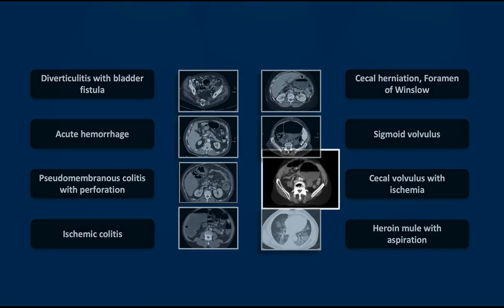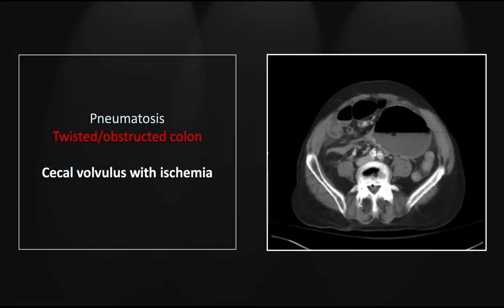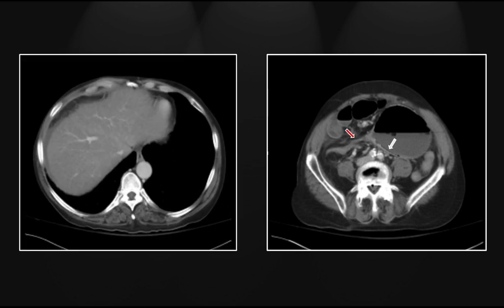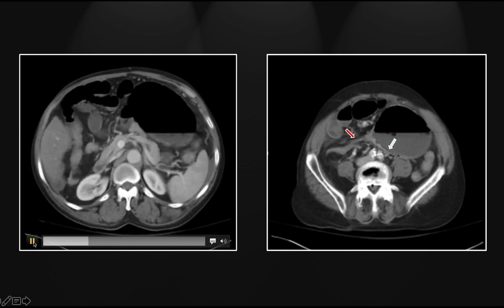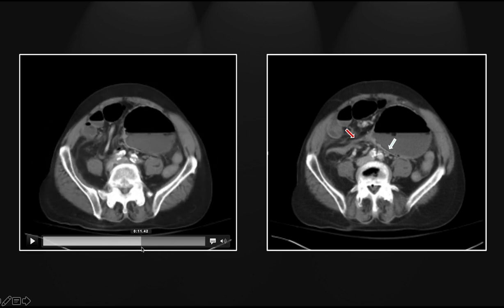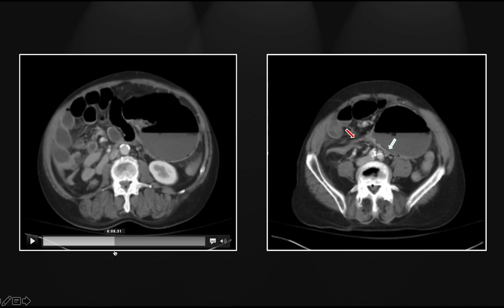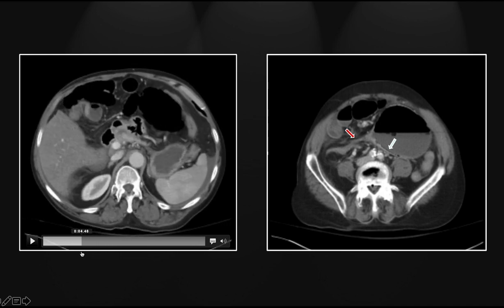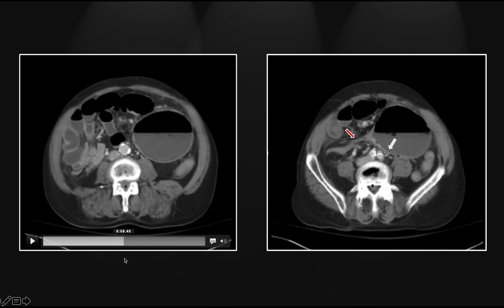Our next case is a cecal volvulus, this one with associated ischemia. There is pneumatosis on the posterior aspect of the twisted and displaced cecum. Adjacent to it, we see another one of those segments of elongation and luminal narrowing consistent with a volvulus. Here again we see the pneumatosis in a markedly dilated cecum. A large segment of cecum has actually been involved with this volvulus and is all quite ischemic.